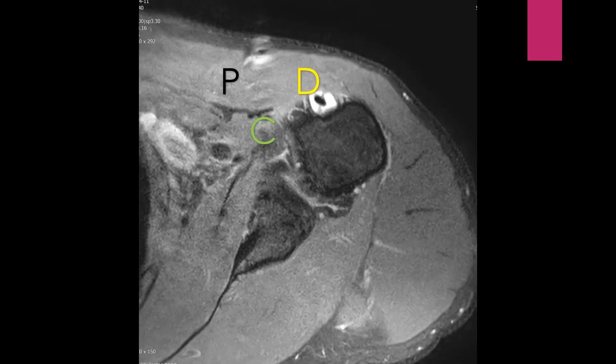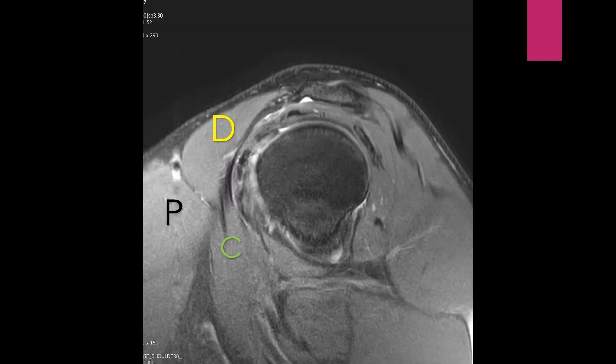Now let's examine the axial view of the inferior capsular attachment site. The anterior aspect and the anteromedial aspect of the inferior capsule is covered by the deltoid muscle, the coracobrachialis muscle, and the pectoralis fascia. The sagittal view provides an additional perspective of the same area. I will provide continuous cinematic axial and sagittal images to help you understand the 3D structures.